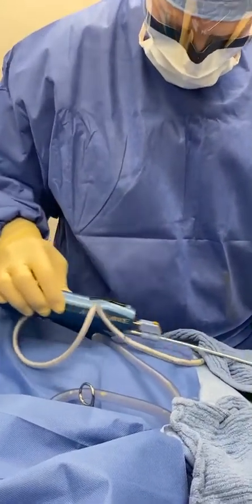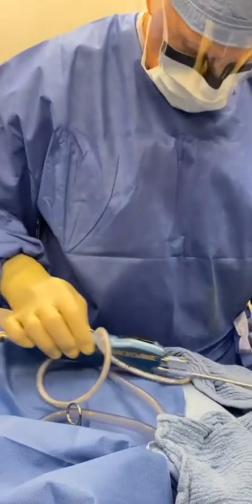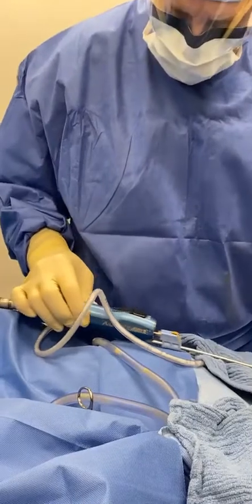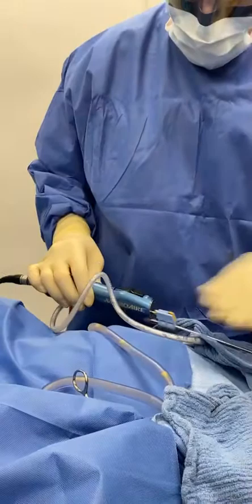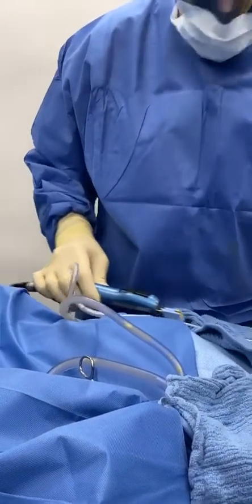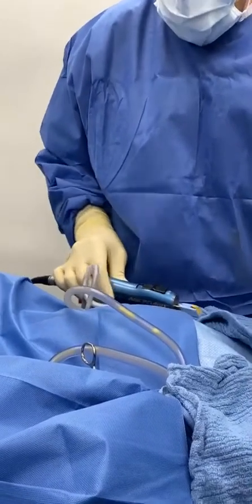She has a little depression in the right outer thigh — very small — that she wants to fill in. So we're going to do a very tiny fat transfer. Look at this — it's incredible, the quality of the fat that we take.